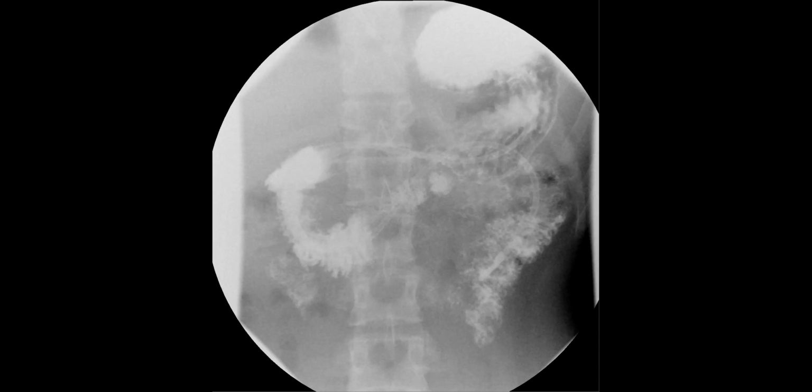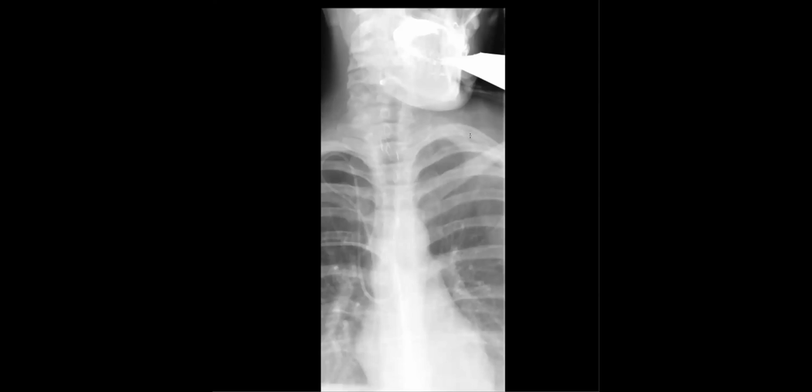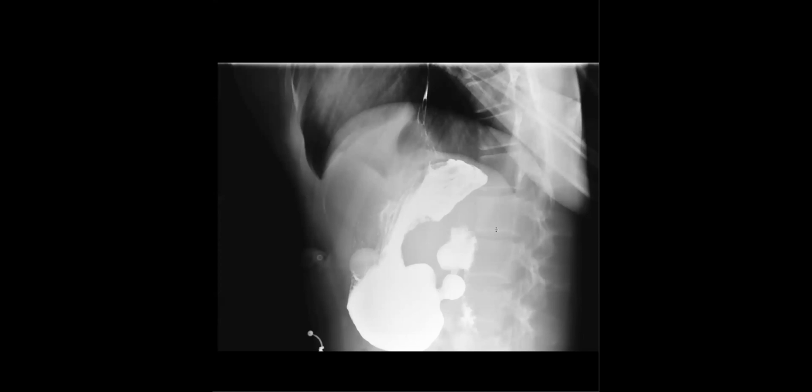So she came back a few years later to reevaluate. She's now GJ tube dependent because she's not able to keep down liquids and food. So then we got a repeat upper GI. This is 2 years later. And I did this, and first I had her sit up and she drank barium, and it pooled and didn't go anywhere. So I brought her recumbent in a supine position, and then nothing happened.